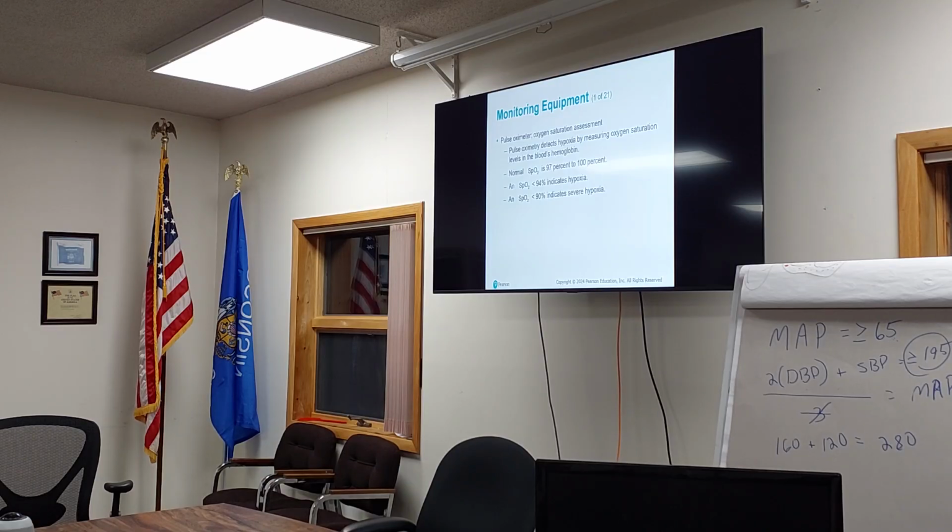And that number can change pretty quickly, let's say over a minute. Anything that disrupts blood flow through where we're testing, so again, ice cold hands, or if you do a cap refill and it's really delayed, we're going to have an inaccurate pulse oximeter.